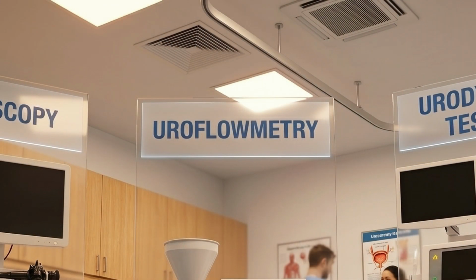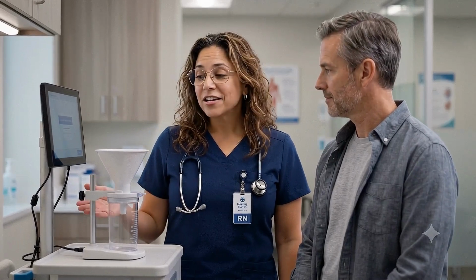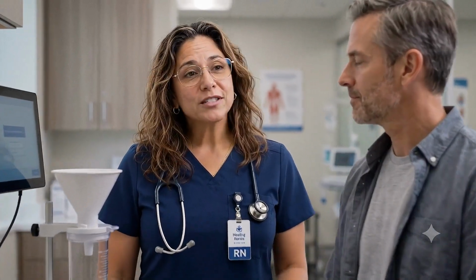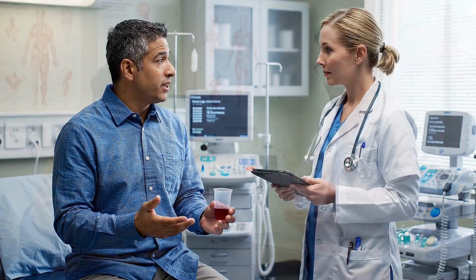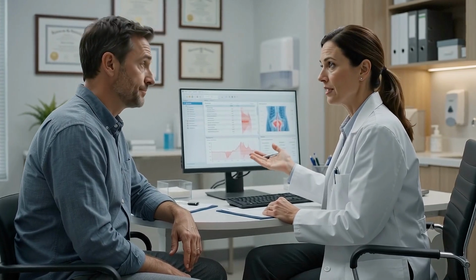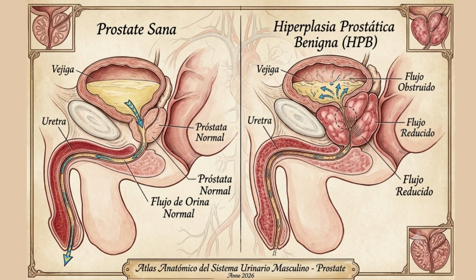Next, let's discuss uroflowmetry. Uroflowmetry is a non-invasive test that measures how well urine flows from the bladder. The results help the provider evaluate how effectively the patient is emptying the bladder. This test is commonly ordered for patients experiencing weak urinary stream, difficulty initiating urination, urinary retention, suspected obstruction, or symptoms associated with benign prostatic hyperplasia.